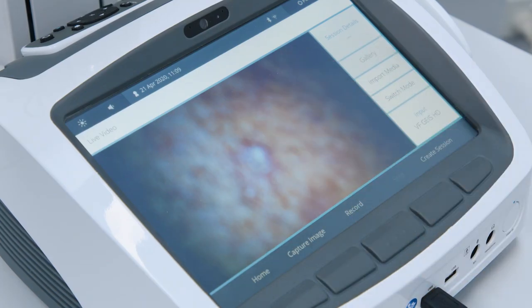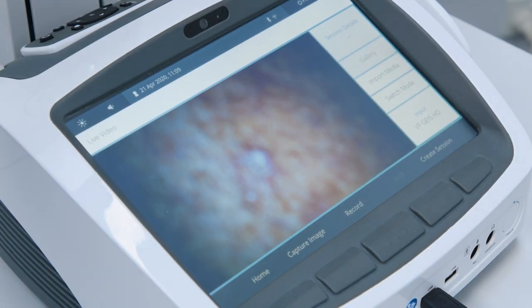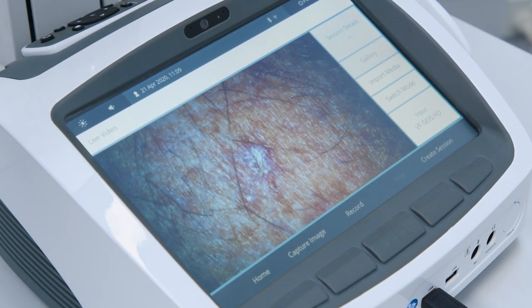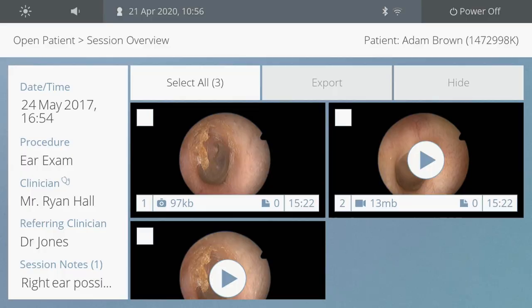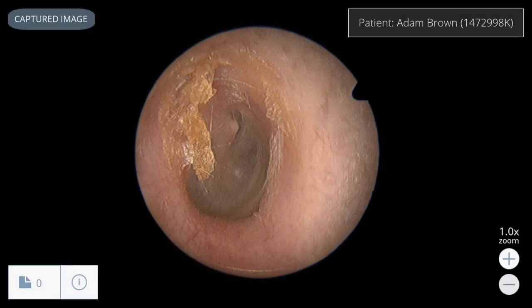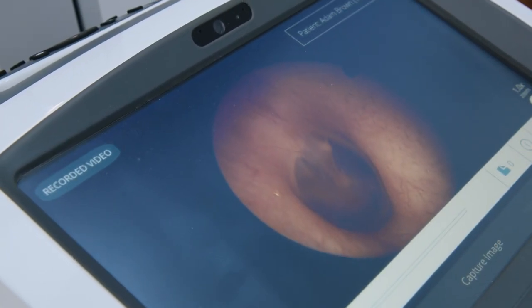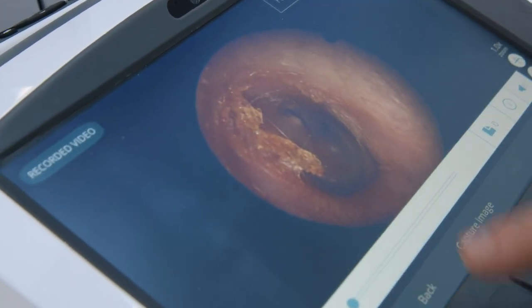Once the area is selected, the autofocus will concentrate on the highlighted region. The images are then saved directly into a gallery, which can be accessed from the patient database.